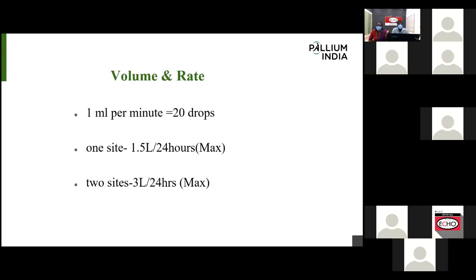Next, we move to the volume and rate of subcutaneous infusion. Mainly, as we know, 1 ml per minute. That 1 ml means 20 drops. That is the maximum rate we can give in 1 minute. 1 ml or 20 drops we can give subcutaneously.